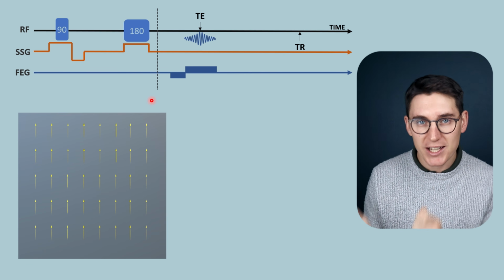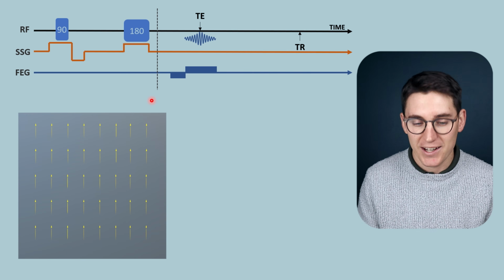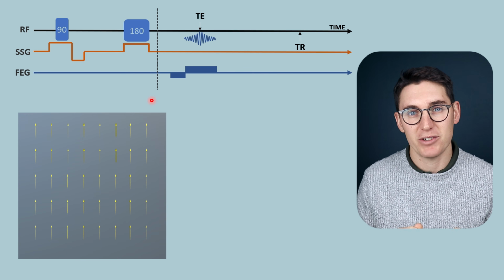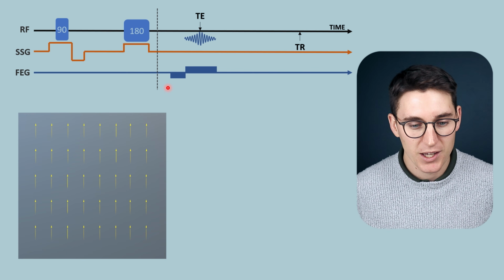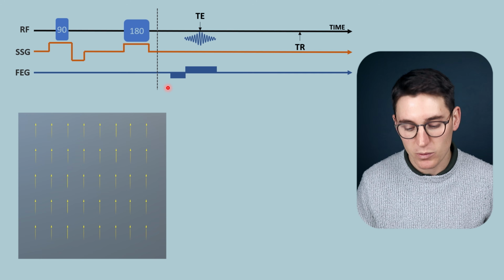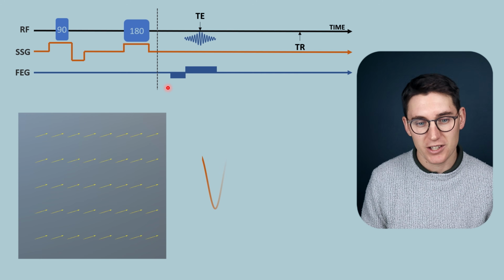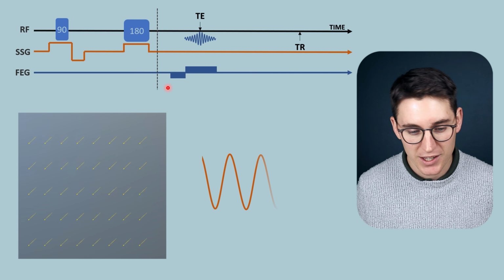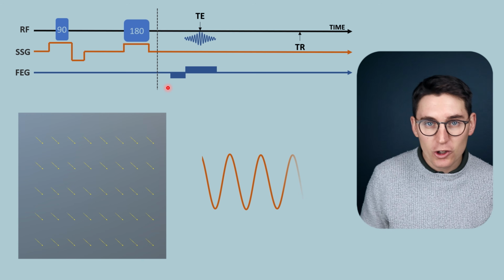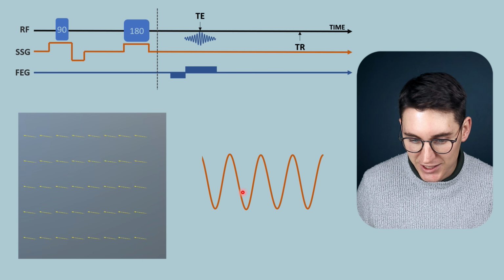And we've seen that precessional frequency is proportional to the magnetic field. And if it's only experiencing the main magnetic field, all of these spins will be precessing in phase with one another. Now, spins that are spinning in phase with one another will provide a sinusoidal signal that can be measured out. Remember, we have yet to apply that frequency encoding gradient. Now, these spins are accumulating because they're in phase with one another, giving us a net magnetization vector that looks like this.